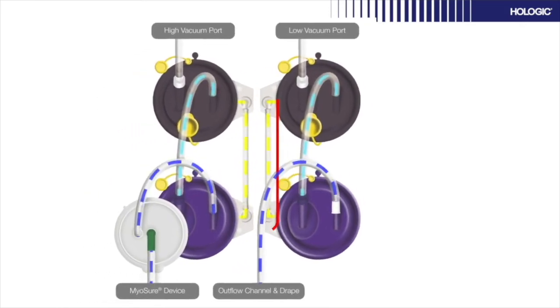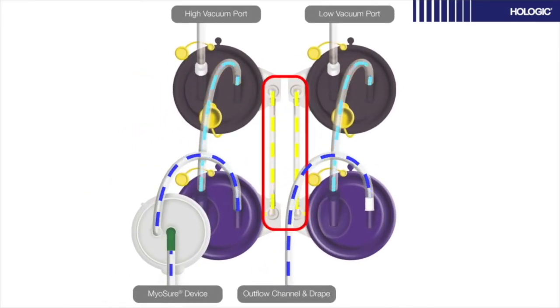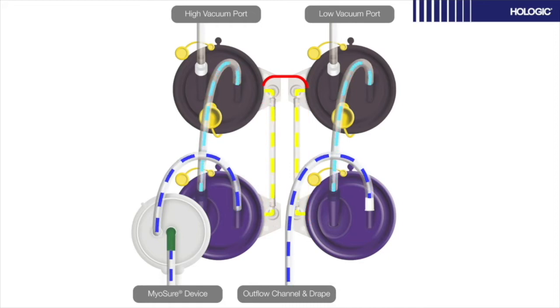The air will now be drawn through the canister set as shown. The yellow marks indicate the flow of suction from both the constant low vacuum on the right and the adjustable high vacuum on the left, which work independently. A reminder, this vacuum tubing is reusable and can remain connected to the canisters.